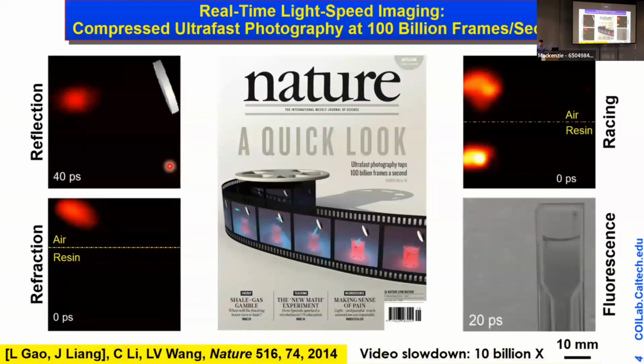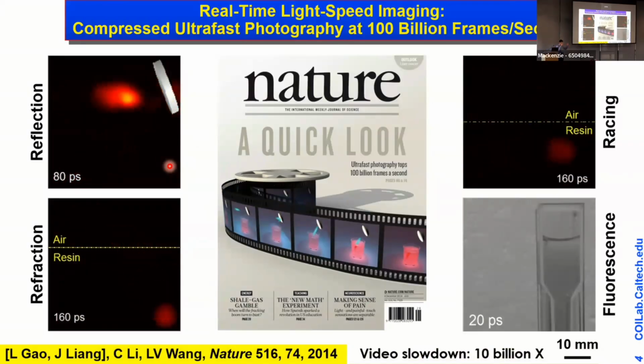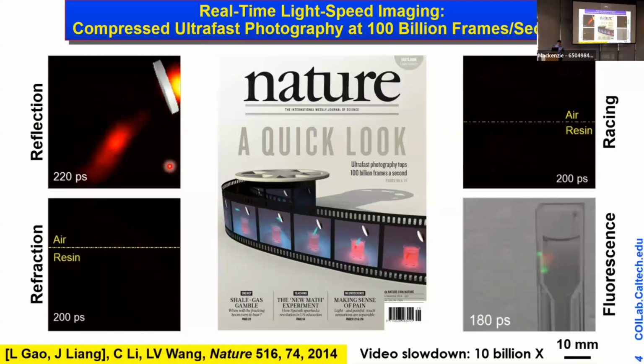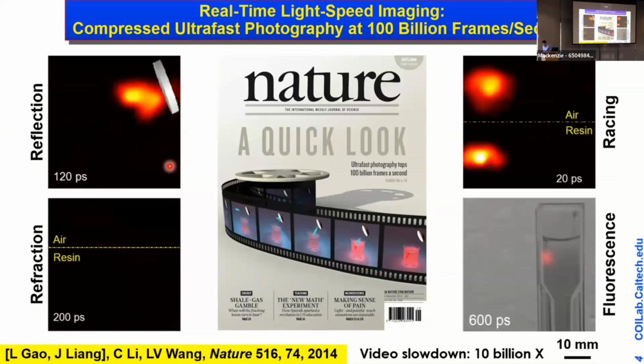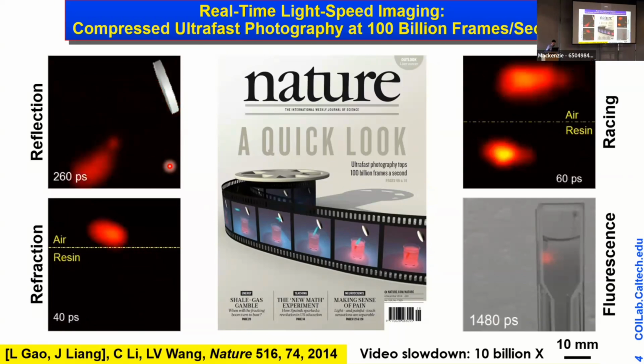So that was sonic speed imaging. We're at the physical limit in terms of imaging. So within the acoustic arrival time, we acquire enough data for an image. So that's as fast as you can get, right? The minute you receive all the signals through acoustic propagation, you form an image.